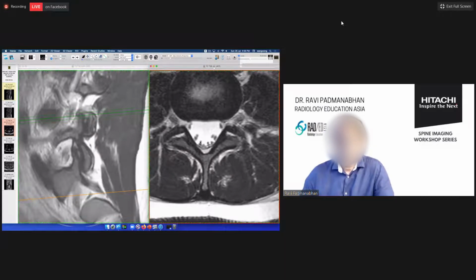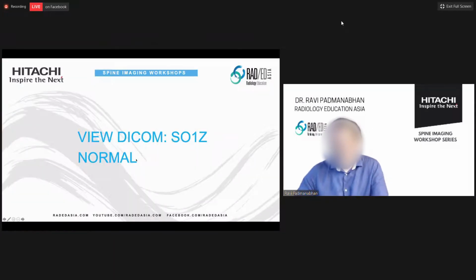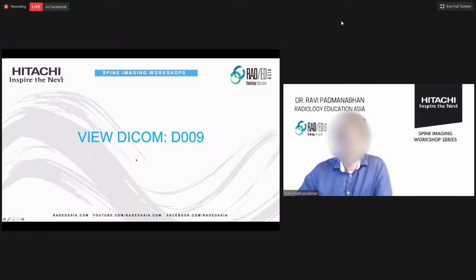So let's go back to the PowerPoint, and we're going to start looking at some cases. So let's look at these.